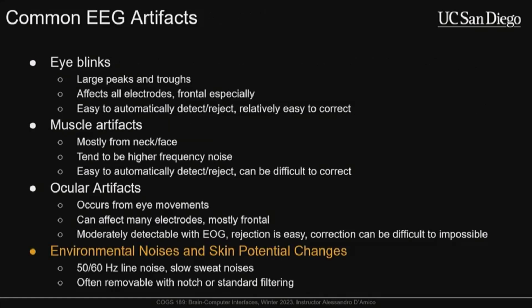Okay? And then the final set of things I'll talk about are environmental noises and skin potential changes. These are the things that you sort of can't do anything about for the most part. They are just constantly around us.